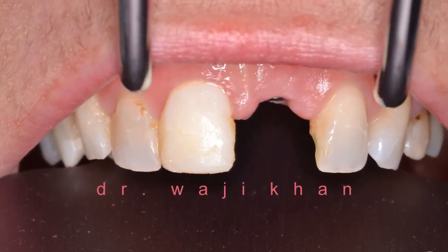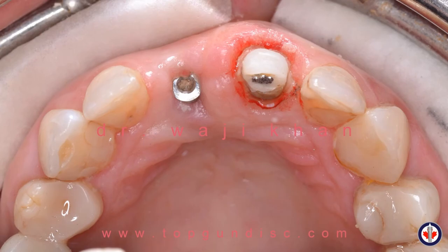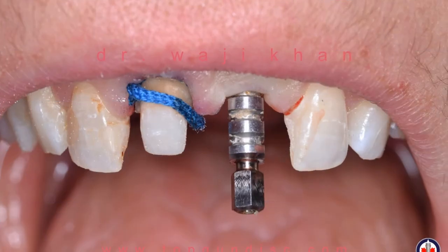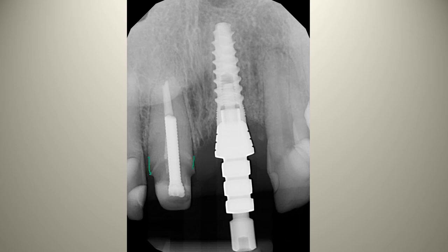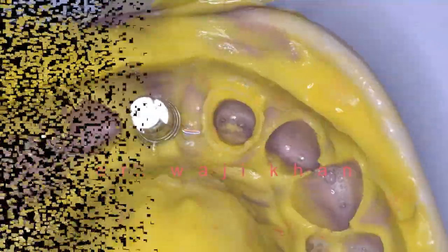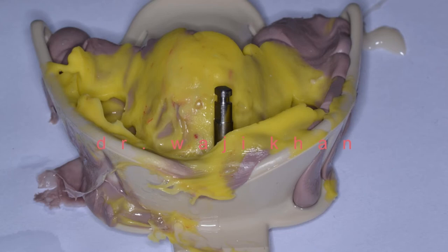Here's the patient after healing and after removal of the roll flap suture — we were able to augment the soft tissue nicely. It's time to take an impression. We remove the temporary crown, clean up the margins, place retraction cord, use a transfer coping, and take a radiograph to confirm seating. The radiograph also confirms we are not impinging on the biological width of the upper right central incisor. We take both impressions simultaneously: a fixture-level open-tray impression and an impression of the crown.